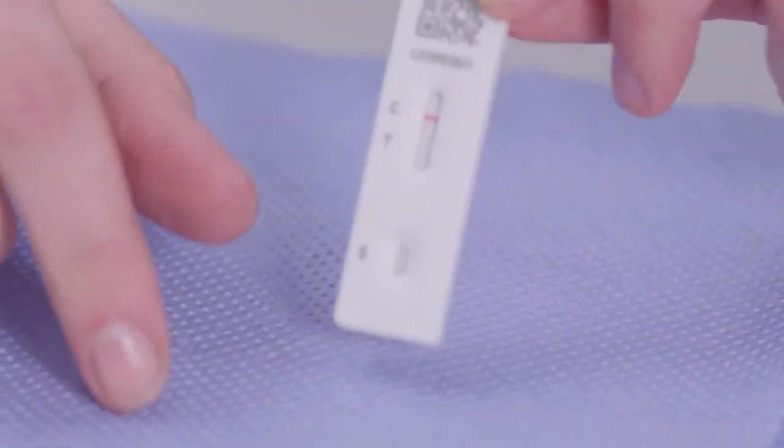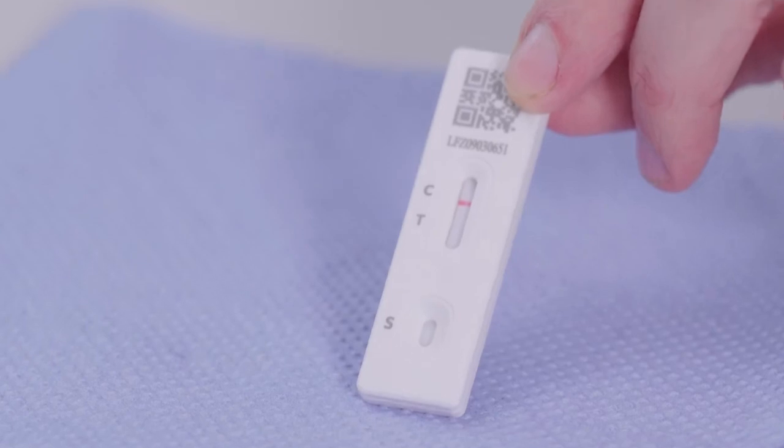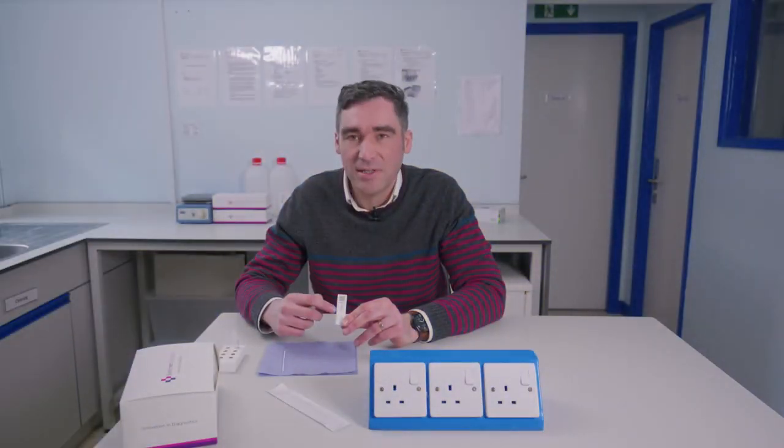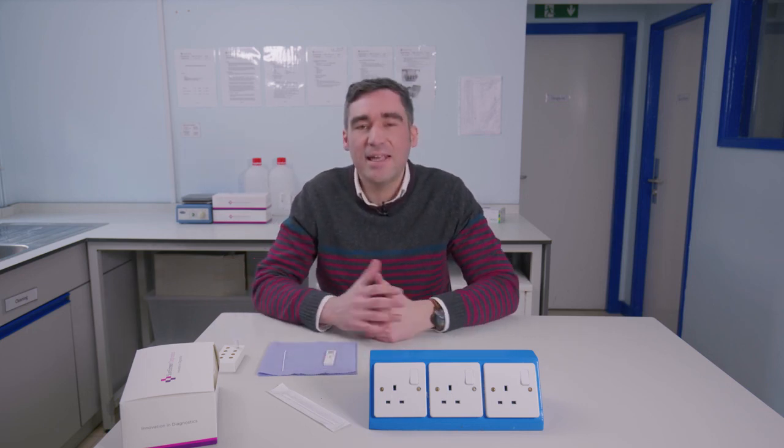Ten minutes have elapsed and it's time to have a look at the result on the cassette. They're really easy to read — what we're looking for is a line at the control region at the top, denoted by C, and then the presence or absence of a test line at T. In the case of a negative result like this one, there's no line that forms at the T position, so this is a negative result. With a positive we'd expect to see a firm line at T as well. It's a really easy test to administer — just getting a sample from the front of the nose, less invasive than something like a nasopharyngeal test. If you'd like to know any more about this test, please contact us at SureScreen. Thanks.